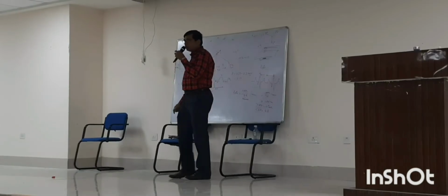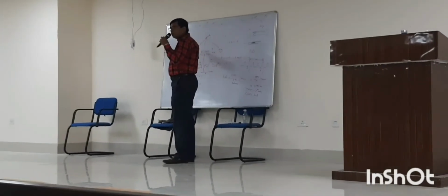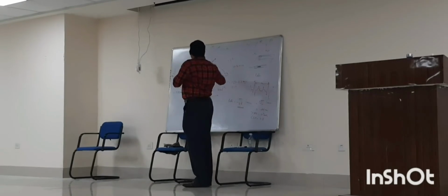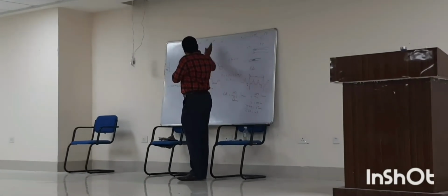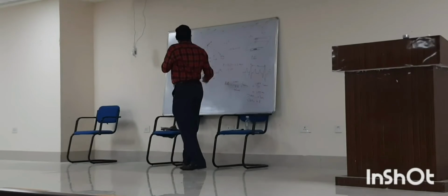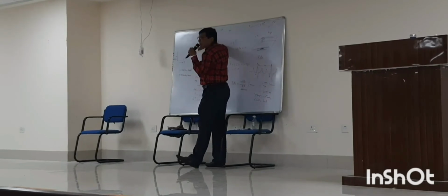You have to calculate the angle. It makes an angle of 90 degrees. If both are positive, there is a normal axis. Lead 1 positive, AVF negative, chances of left axis deviation. AVF positive, lead 1 negative, chances of right axis deviation.